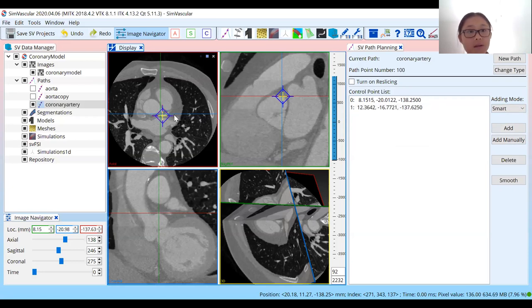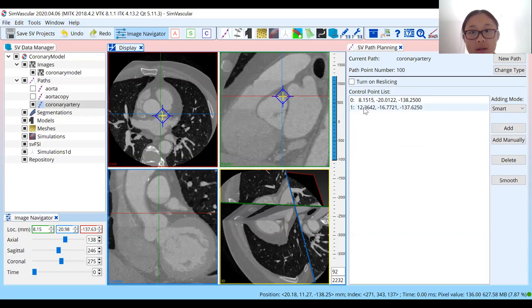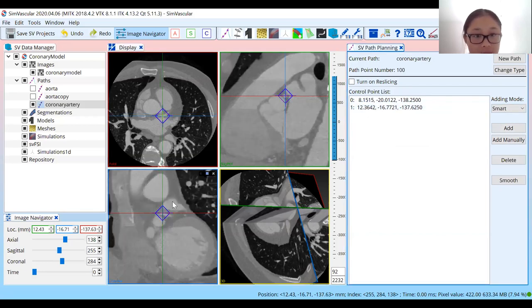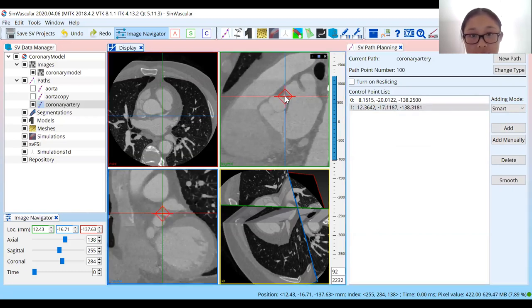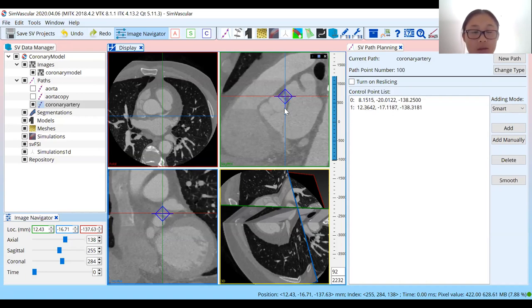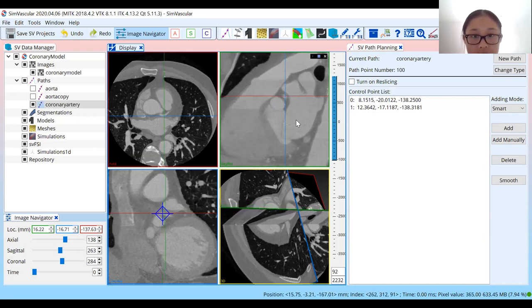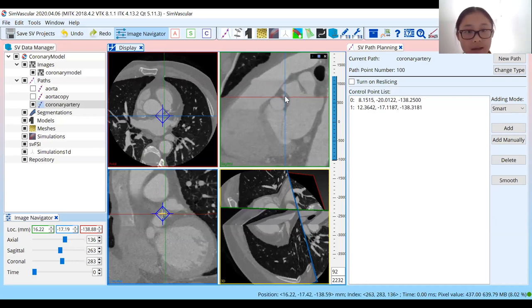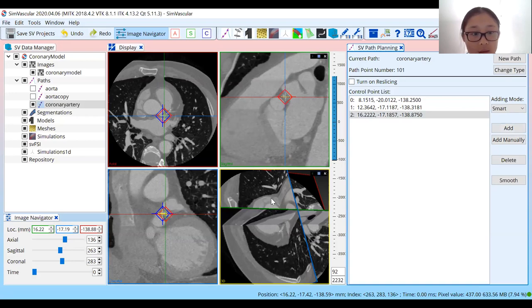Even if your crosshairs aren't exactly there, you can add another point roughly on that vessel. Click on the new point and your screen will change. Right now we see this in the sagittal plane and we see a circle — that's the plane we can continue in until the circle disappears or isn't clear anymore. If we continue scrolling, the circle definitely continues, so we can keep plotting in this sagittal plane. You would do this for all the vessels.